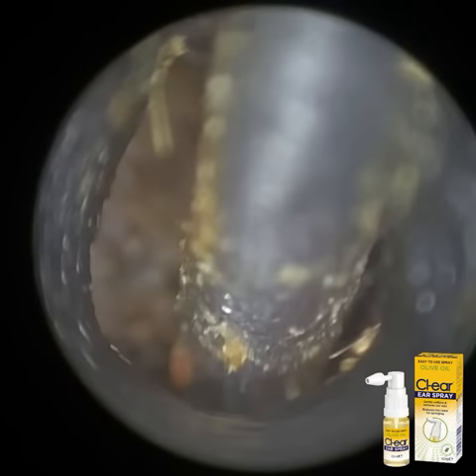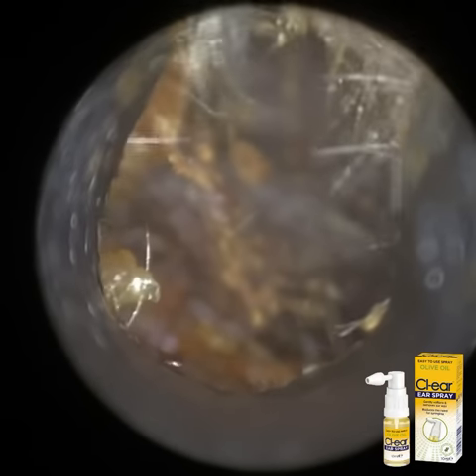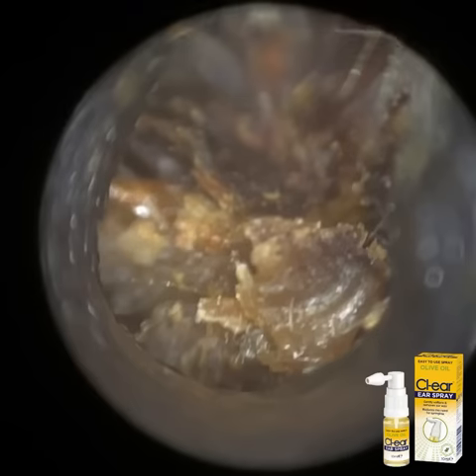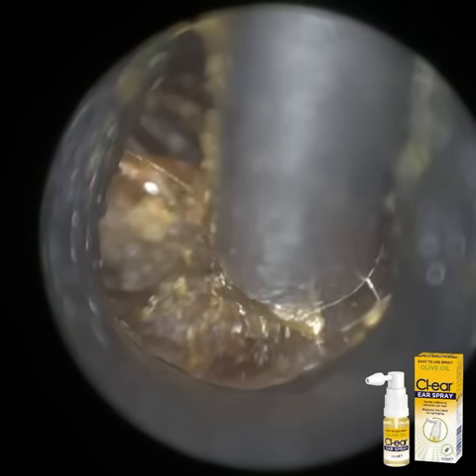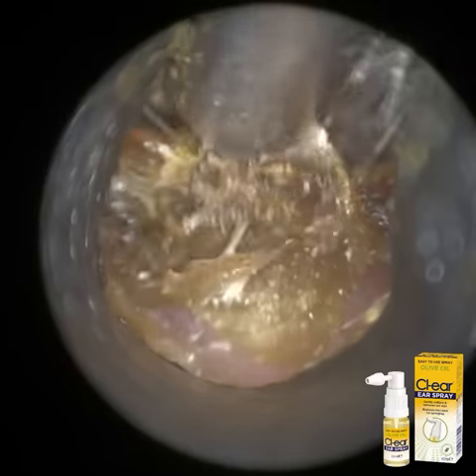And the function of the olive oil spray, so you'll see in a moment, the wax is still quite tough, and I'm just going to use some olive oil just to loosen, soften this wax. With certain consistencies of earwax, it can be quite mushy and glutinous, and it's very hard to suction. And it's very hard to use any other instrument with that consistency of wax.